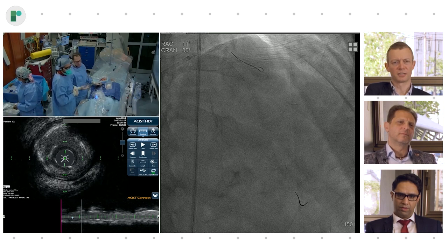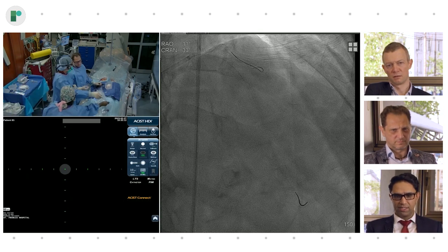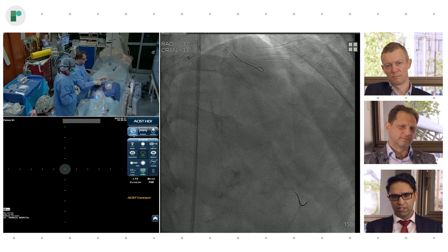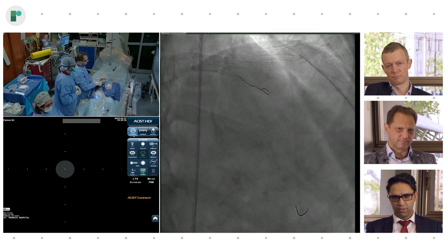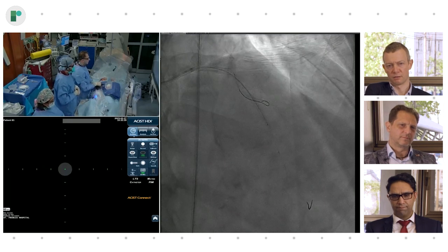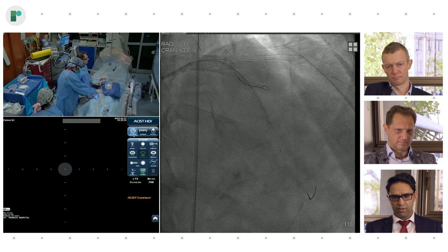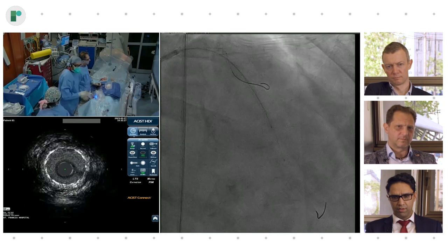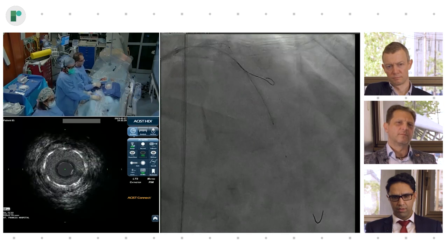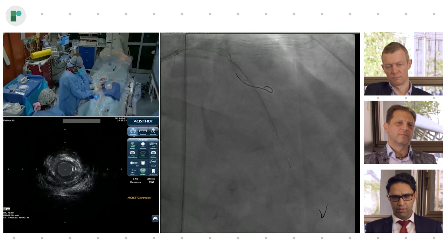So you hear him injecting some? We're going to inject saline, like Alan said, to help delineate to see whether we can see better by clearing the blood using a saline injection. Just with the syringe, right? Yep. So let me zoom up one. That part looks great. Here it is, right?